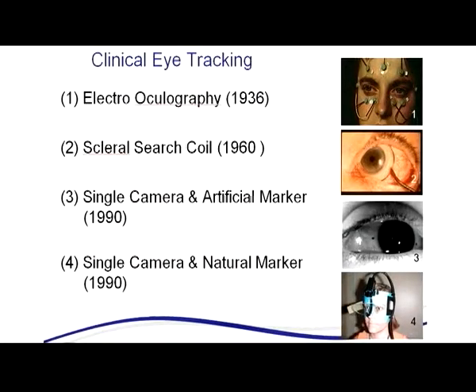And right now, there are a lot of eye movement tracking methods. The first is electrooculography, where they put sensors around the eye, and also we have the scleral search coil. They install the coil on a contact lens inside the eye, and then they connect it to electromagnetic frames, and they can measure the eye movement directly in 3D.